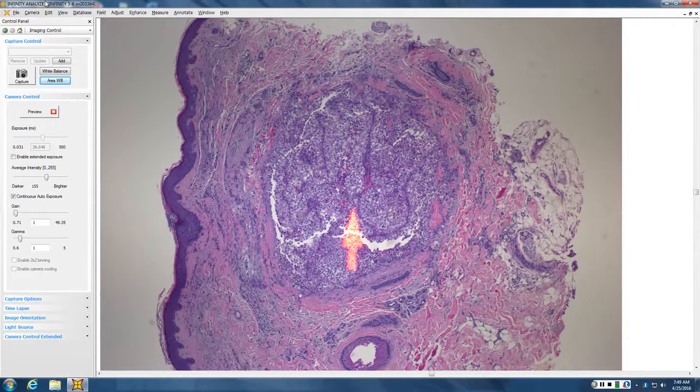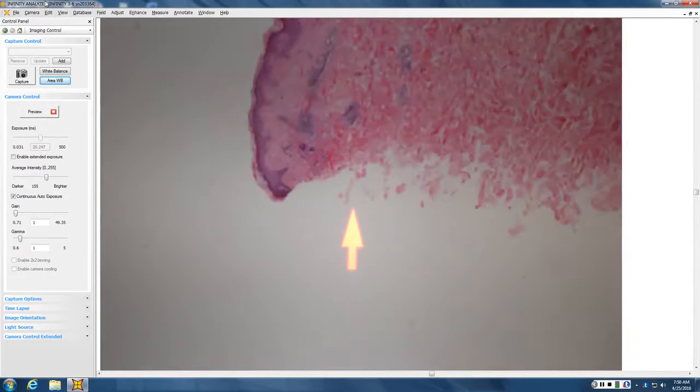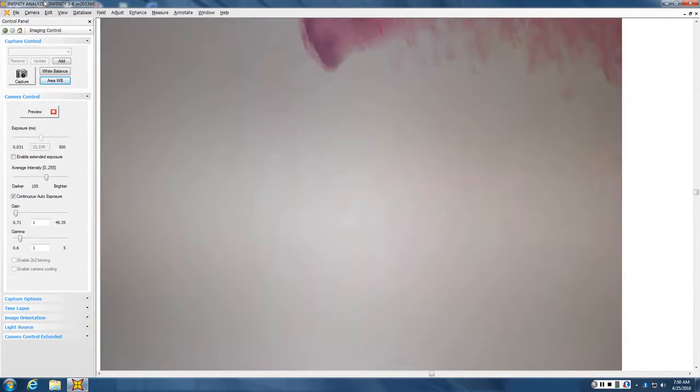But the skill set that would be appropriate for practice and the at-hand knowledge you'd need for testing is to recognize it on H&E, because you have to suspect it. That's the first step. So round to oval nodule, tubules of clear glycogenated cells, bloody, and that's about that.